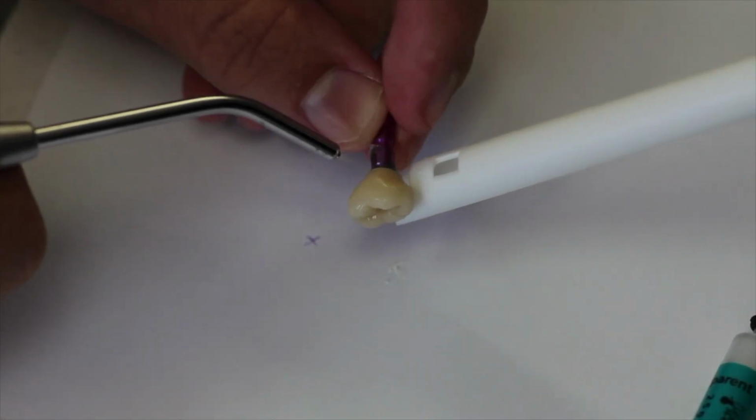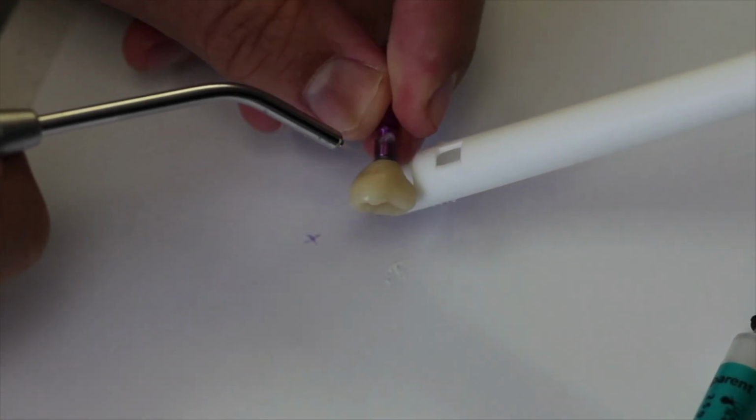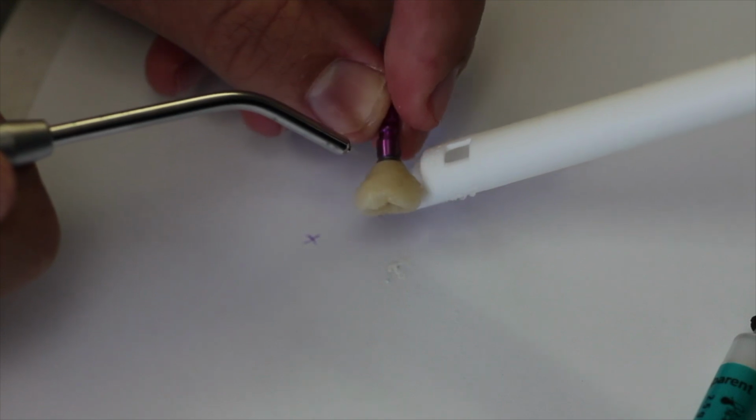After letting the complex auto-polymerize for up to 7 minutes, we can go ahead and rinse the glycerin gel completely off the restoration.